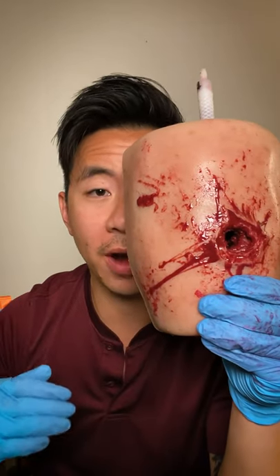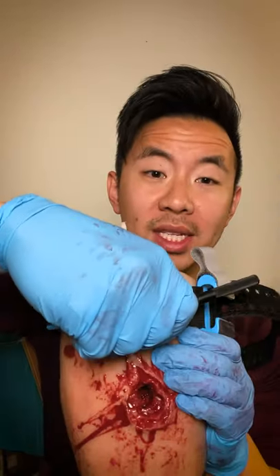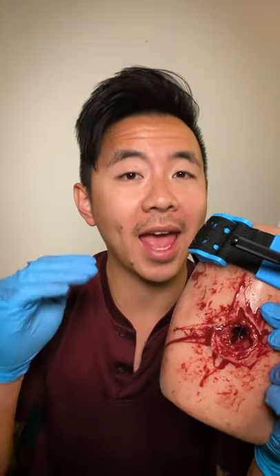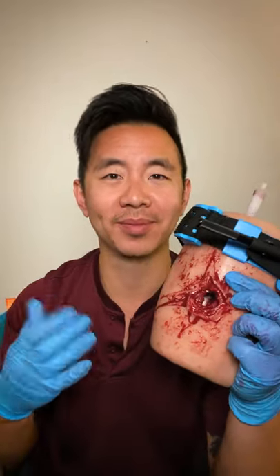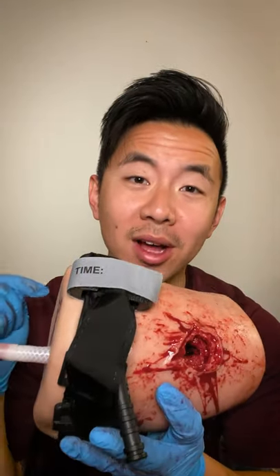In a non-active shooter safe environment, you want to go two to three inches above the wound. Pull until it's tight. Twist, twist, twist until there's no bleeding and there's no pulse. Can you guys tell me why? Secure your tail and write your time. Now the clock's ticking.